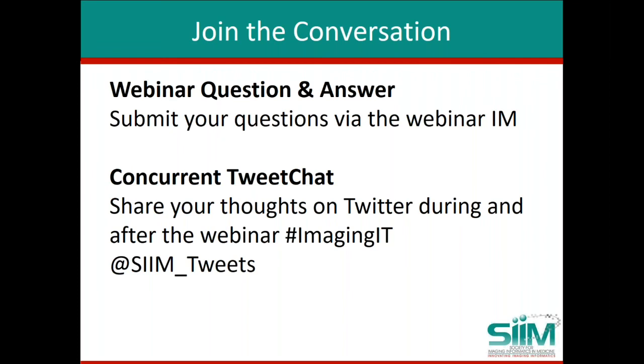How about for the other projects? Everyone else on the panel? For Cornerstone and OHIF. Cornerstone is primarily a client-side framework, so it doesn't apply, but the OHIF viewer does have a Meteor component, which is Dockerized, so you can spin it up pretty quickly using Docker. The instructions are on the GitHub site.